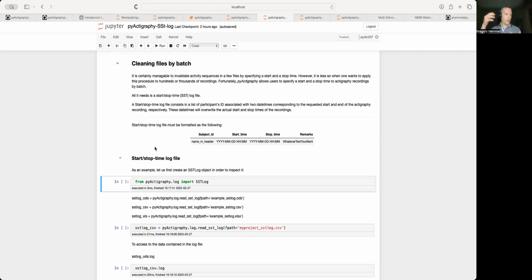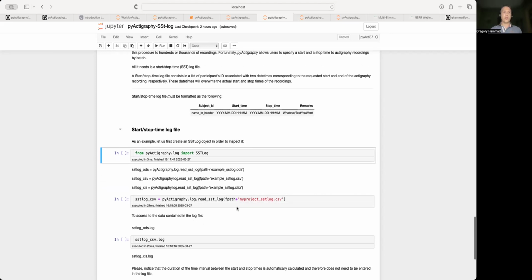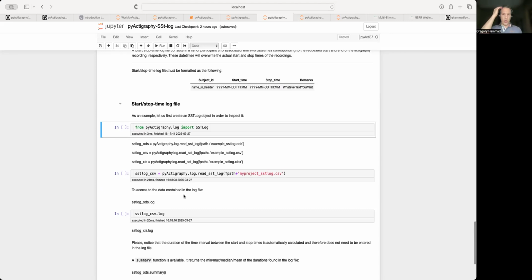So it's a way to make permanent all the knowledge that you gather by visually inspecting your data. Instead of changing the raw data, which is sometimes something that you cannot easily roll back to, we decided to use companion files: the mask files and the start and stop log files. If you have ideas for alternatives, we're always happy to discuss that.